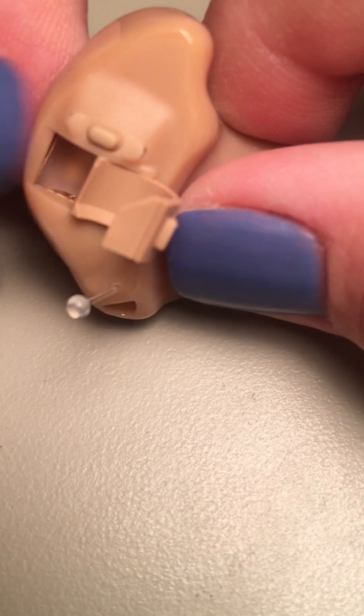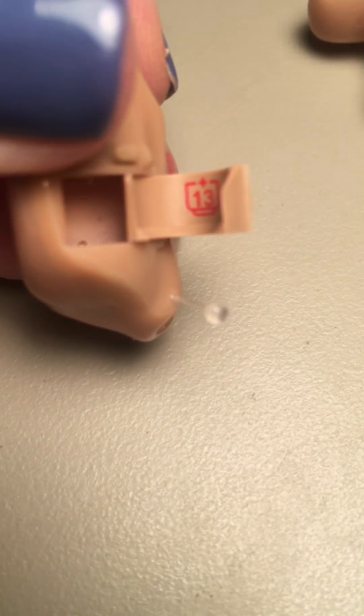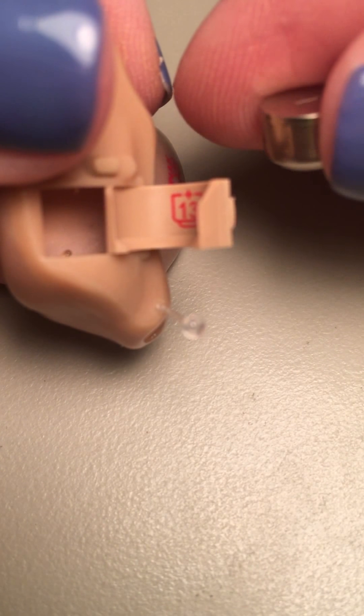This part right here is your battery door. At night, all you're going to have to do to turn this hearing aid off is just open the battery door like that. And if you look inside, there's a little icon in there that shows you how the battery goes in.